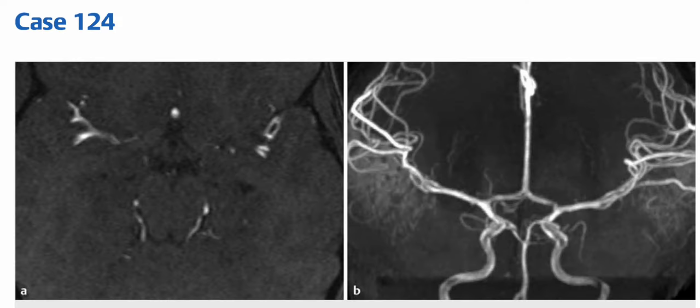So this is a young girl who has presented with a known congenital brain malformation. These are the images, the source and three-dimensional volume rendered MR angiography images through the circle of Willis. They show a solitary vertical A2 segment of the ACA, and there is absence of the anterior communicating artery, that is ACOM.